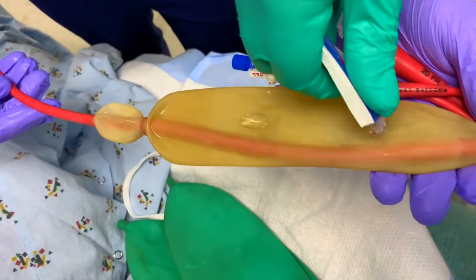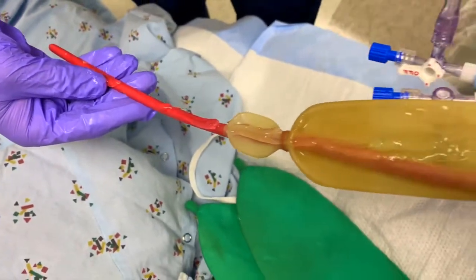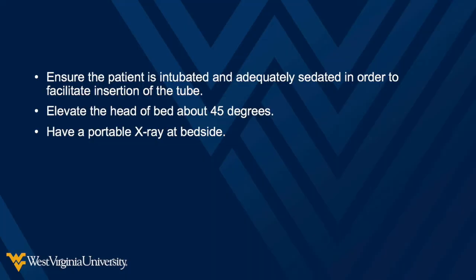Repeat the same steps with the esophageal balloon. With the balloons deflated, apply a generous amount of lubricant along the length of the tube. Ensure the patient is intubated and adequately sedated in order to facilitate insertion of the tube. Elevate the head of bed about 45 degrees and have a portable x-ray at bedside.